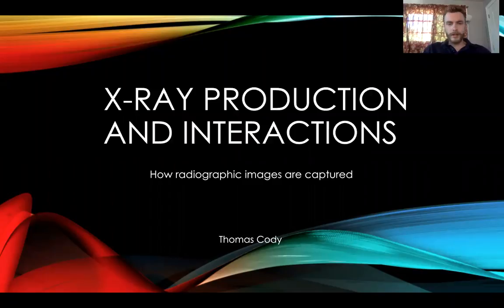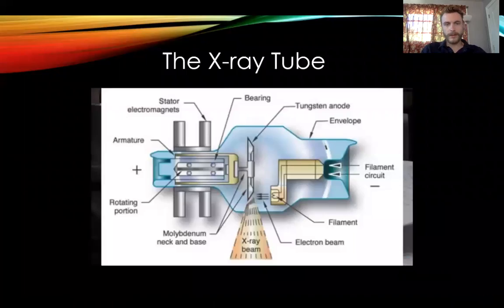X-ray production and interactions, how radiographic images are captured. Now, first things first, we have the X-ray tube. So this is a picture of the X-ray tube.